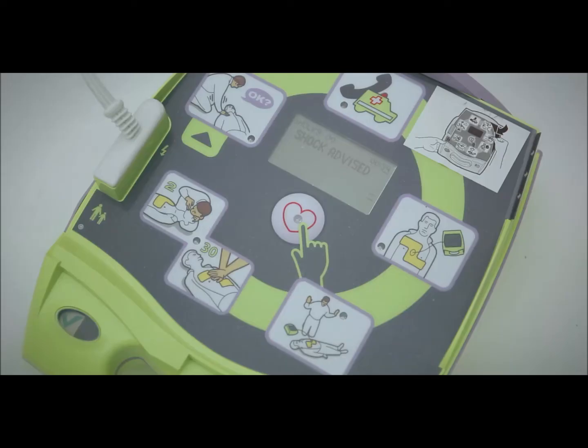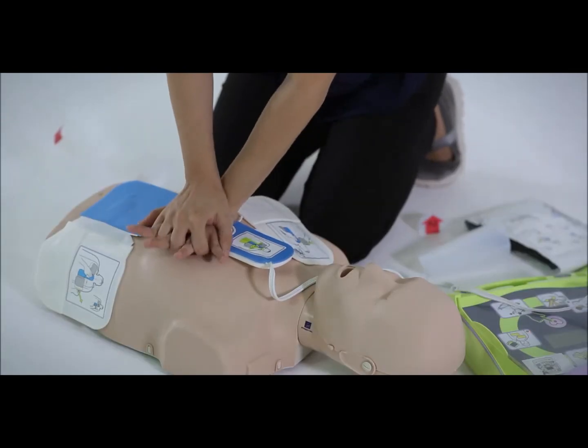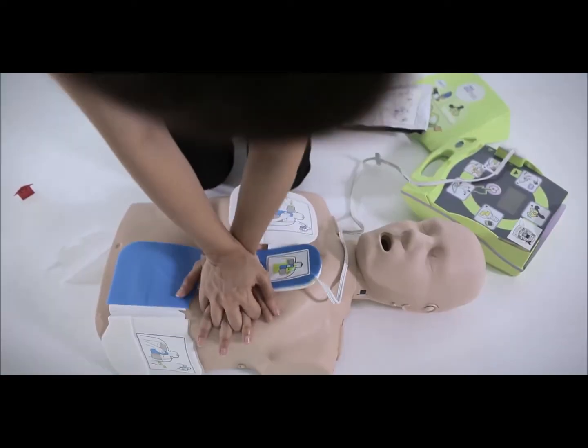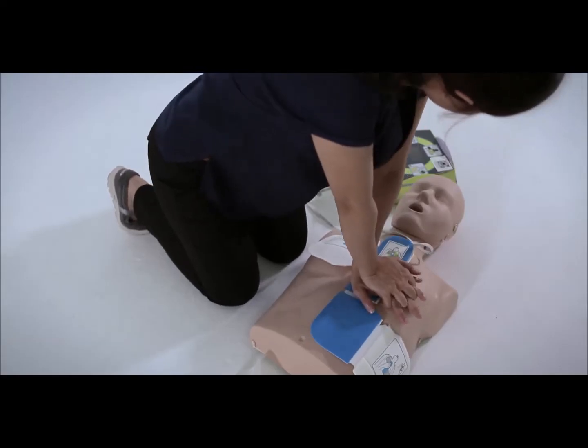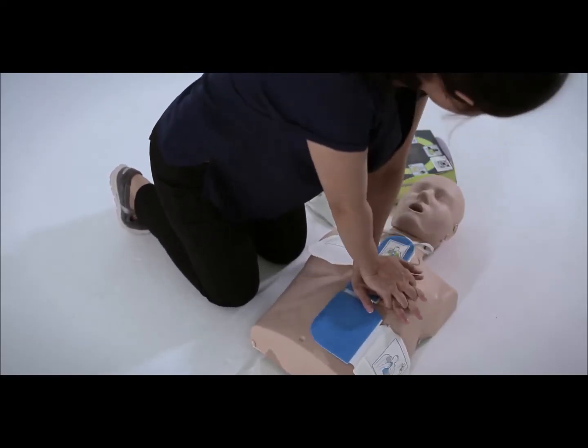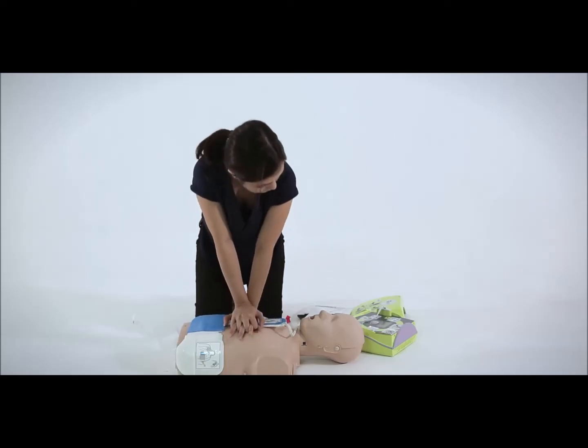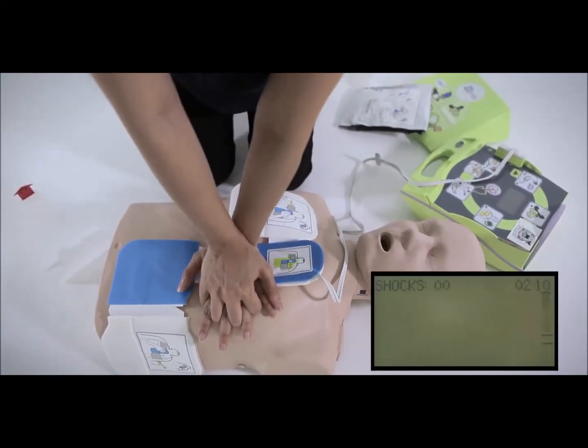After the shock is delivered, or if the AED determines no shock is needed, the AED will advise you to perform CPR immediately. Place your hand on the CPR sensor and deliver chest compressions to the victim. You will hear beeps or a metronome from the AED, which are designed to guide you to the recommended chest compression rate. Try to maintain synchronization between the beeps and your chest compressions.